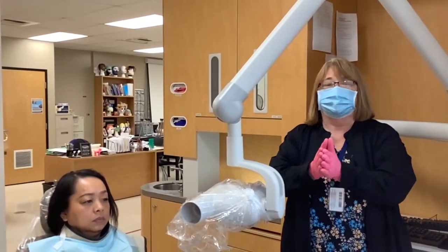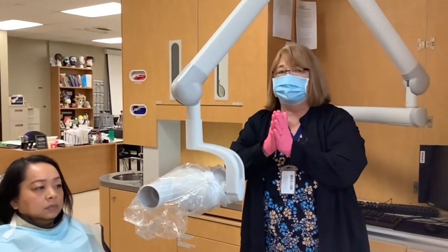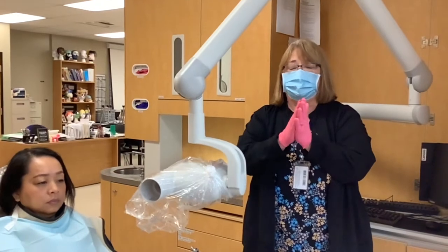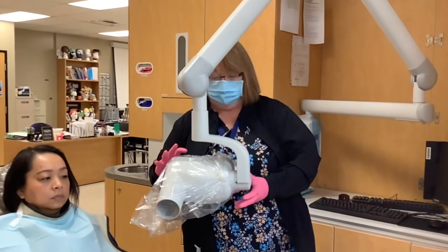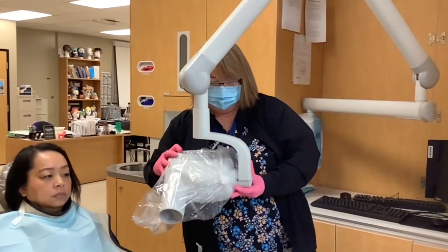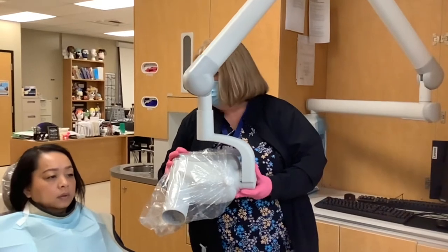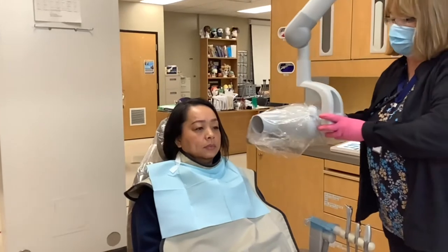I want you all to learn this little song to get the upper angulation: 20, 30, 45, 40. There's my 20, there's my 30, there's my 45, and I'm coming back up to my 40. That's my starting ground. We're going to have Hua here help us demonstrate with film in her mouth where to start the angulation.